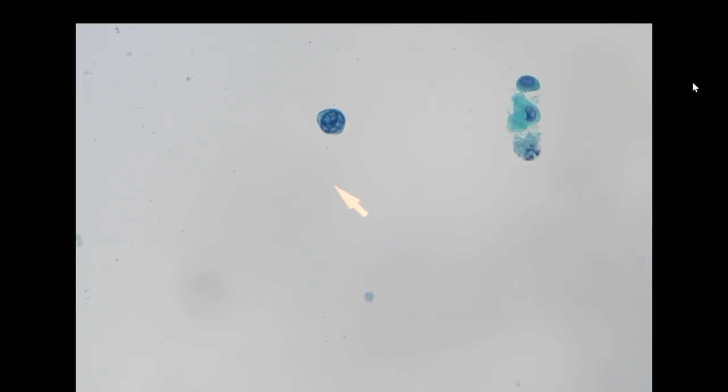The most common scenario would be the upper tract urothelial carcinoma, where we have around 5 cells that look like this. The other situation is if you have a bladder tumor that is carcinoma in situ instead of papillary urothelial carcinoma, it can also present as these very scant but high-grade looking cells. So this case we are also going to call suspicious for high-grade urothelial carcinoma, and this is the cell that we want our screener to look for when we do the screening for urine cytology.